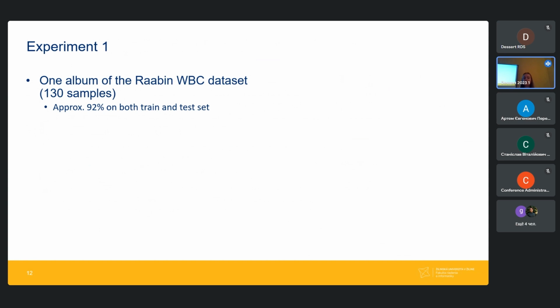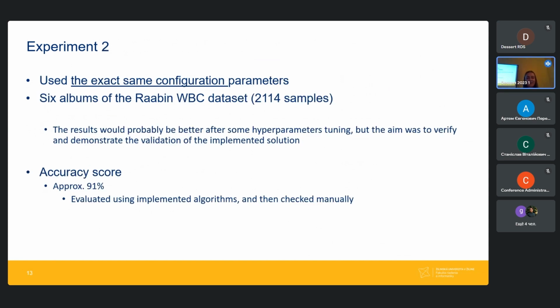mostly manually, because it was just hard to implement in the system if the leukocytes are not labeled by the experts, because it would break the evaluation. The graphs would really support this, but I'm doing my best. I don't know why they are not in the presentation.